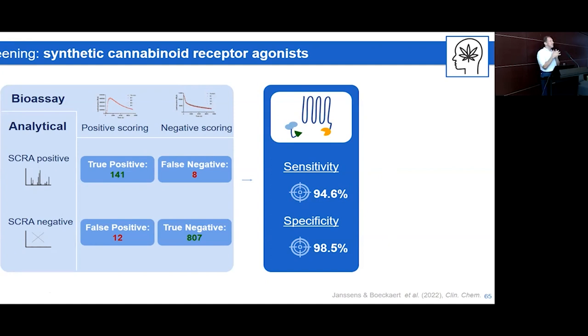Specificity isn't 100% because in some instances we had a small bump and wondered, would this be positive or not? We were on the cautious side and said, this is to be applied as a screening approach, so let's consider it a positive. Eventually it turned out to be a bit of variation on the blank.